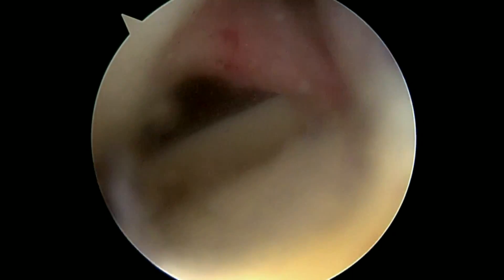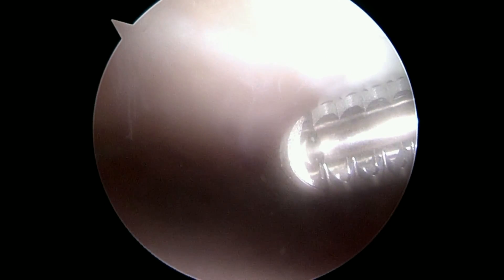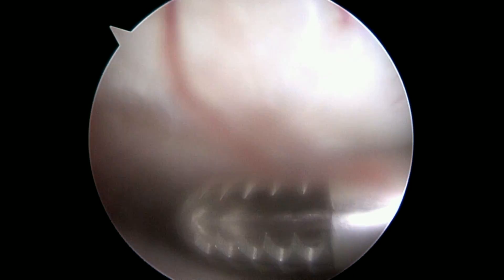Next we're going to look at the patella. Here's the patella, and it looks like this is probably where some of those loose pieces are coming from. You can see here how it's kind of rough and irregular at the top of the screen. I bet that's where that one loose piece came from. Right now I've been going over it with a shaver just to make sure there's nothing else about to come loose. So far so good, we're going to keep looking around.